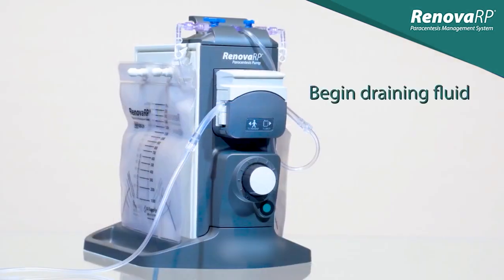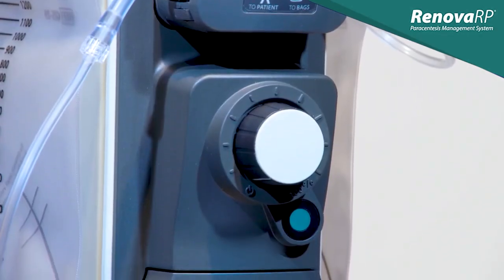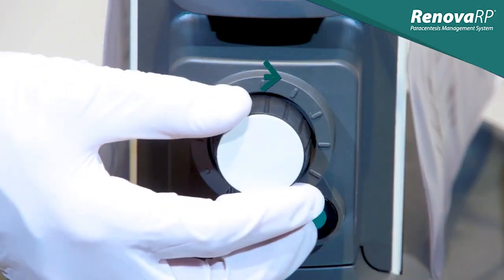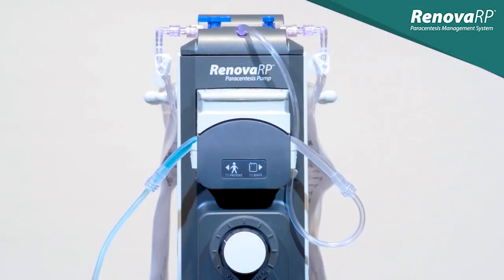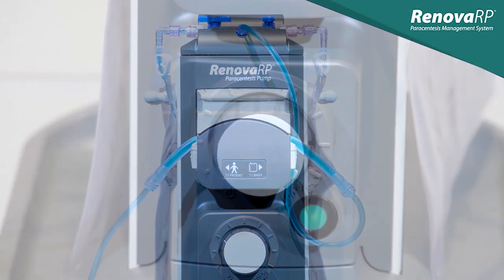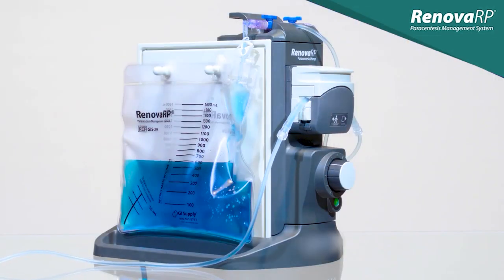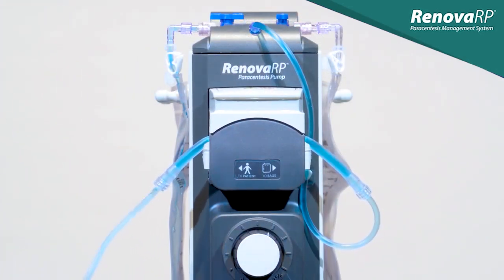We are now ready to begin draining fluid. The pump operates with just one knob that functions much like the volume knob of a radio. When you turn the knob clockwise, the green LED indicator will illuminate confirming that the pump is on. Begin slowly and then gradually increase to your desired speed. This process is designed to give you fine control of the speed at which fluid is drained to maximize patient comfort and procedural efficiency.